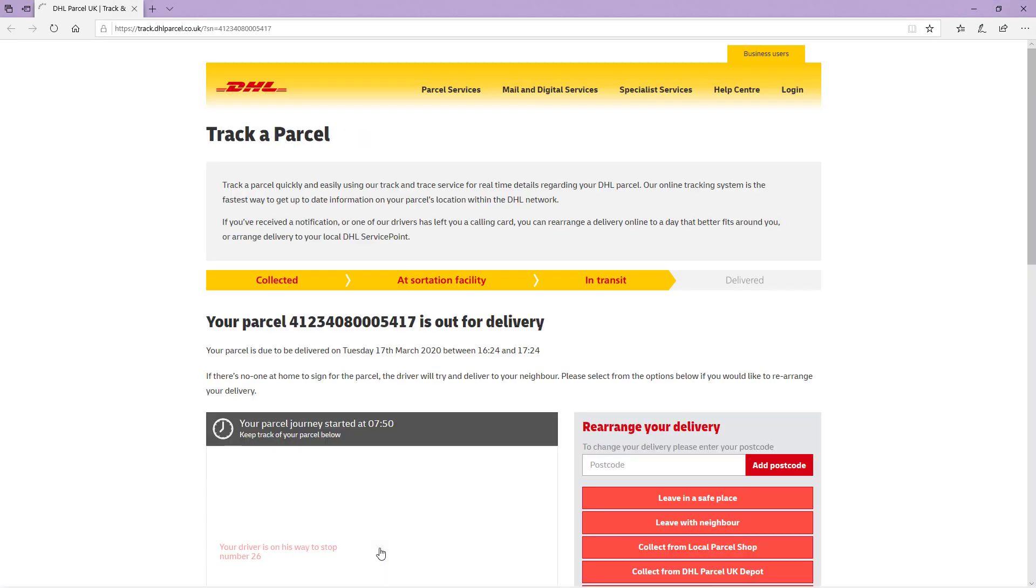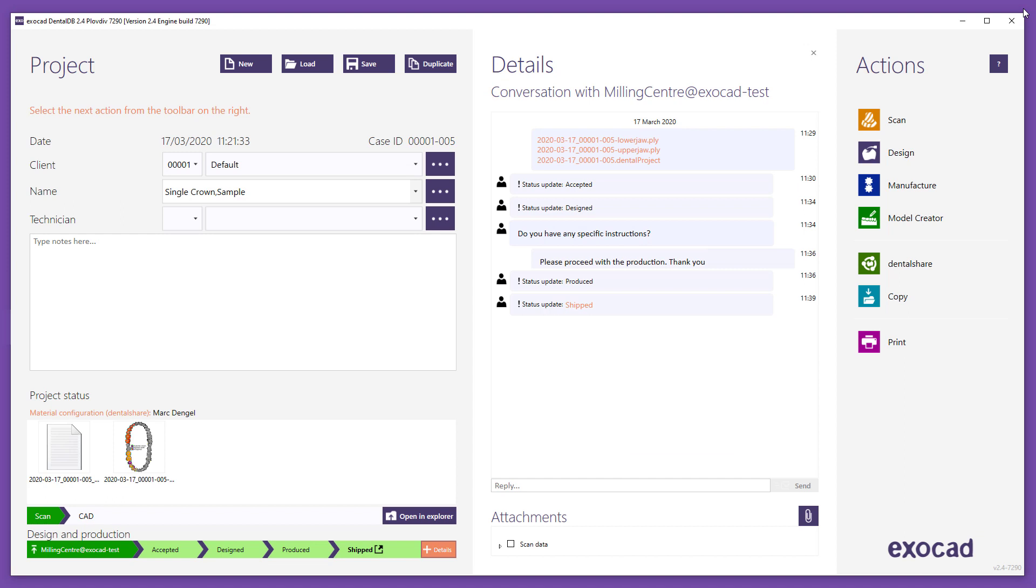Note, the workflow steps described in this video refer to the standard version of DentalShare. The selection of service options and other functionalities can be individually configured by ExoCAD distributors.